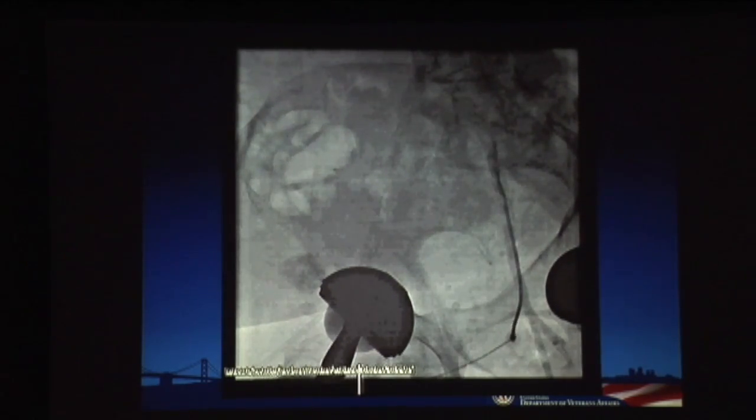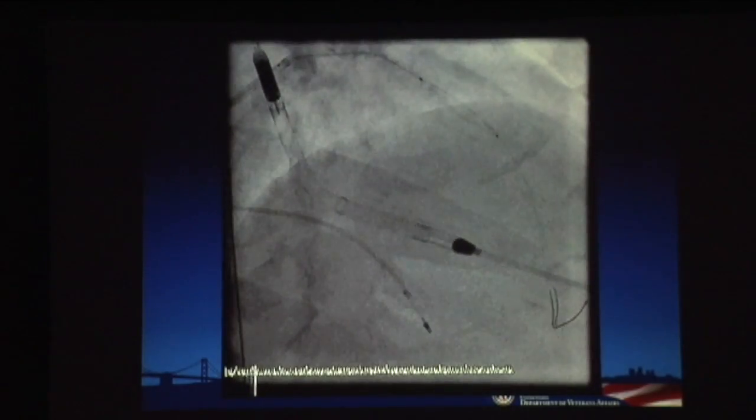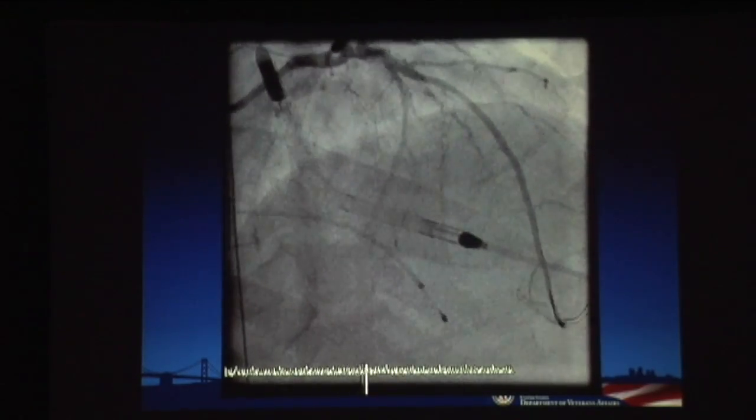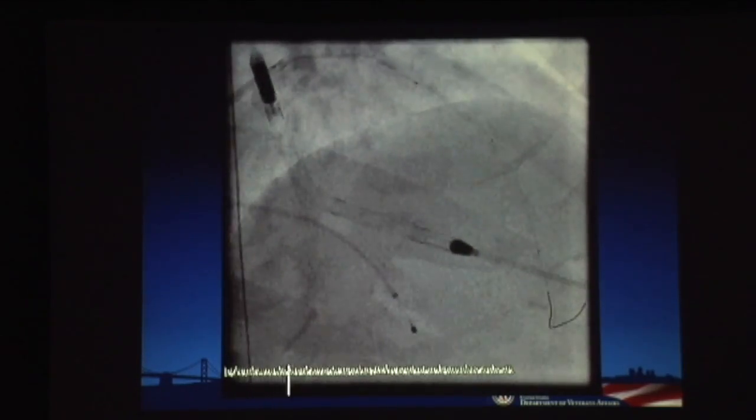So we accessed both groins. Here's the left groin shot here, looking for suitability for support, the right groin here. So between these two shots, we figure we can use one of these for Impella support. They don't look too bad. So an Impella was placed, and you saw in the prior presentations how that's done. I didn't include that here.